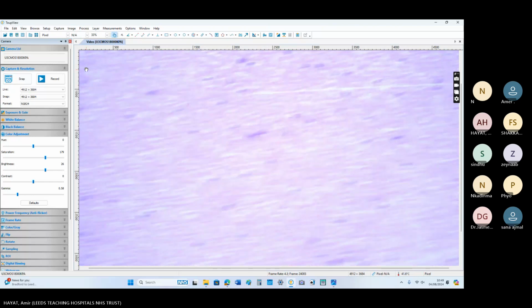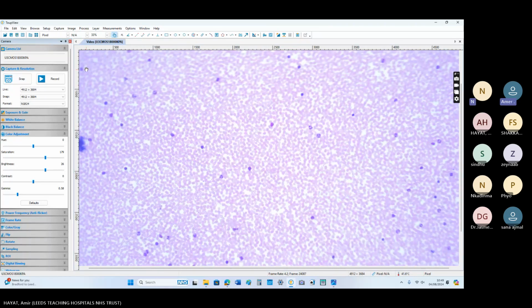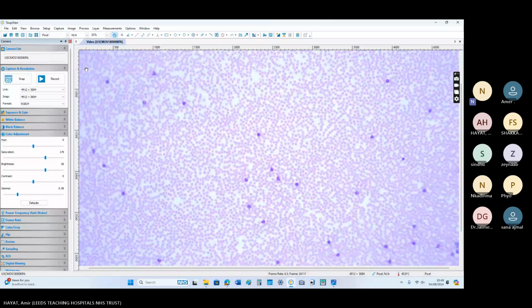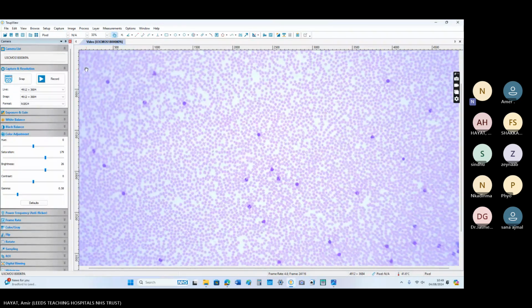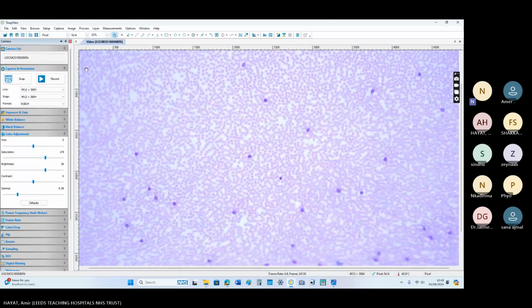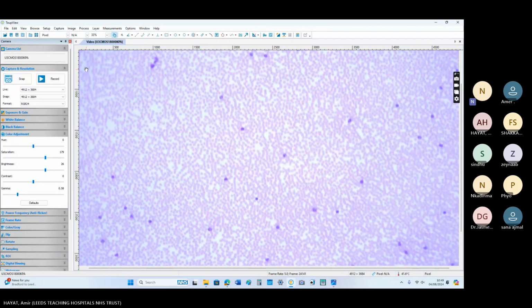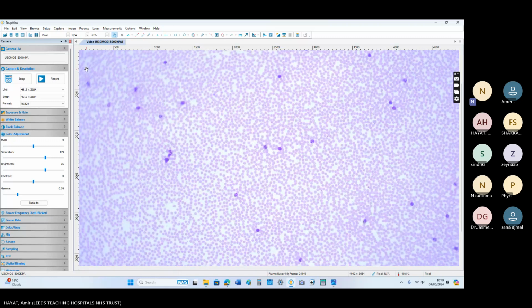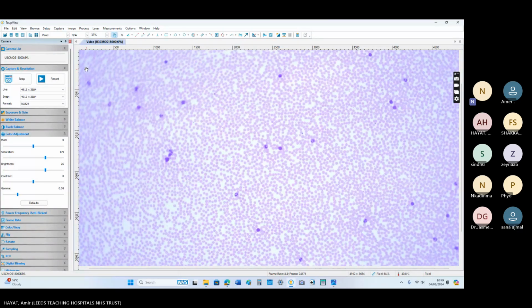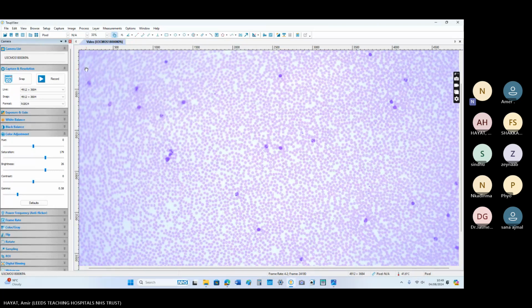Okay. So the last question, Dr. Rama, I have a question. You said they also asked you about the differential diagnosis. My first question is, when you report this case, you will write that there is a myeloid hyperplasia and your findings are consistent. Will you say that your findings are consistent with chronic myeloid leukemia and you want to confirm it with either FISH or BCR ABL?